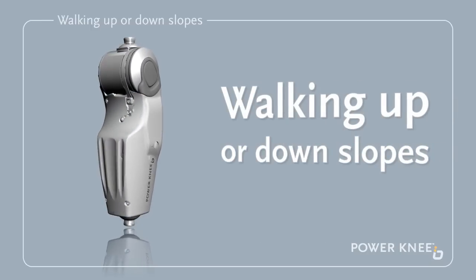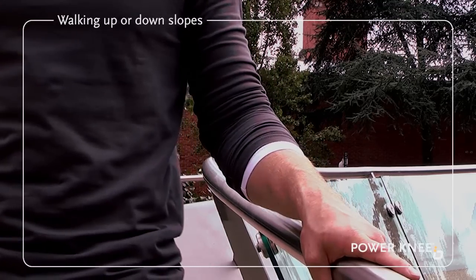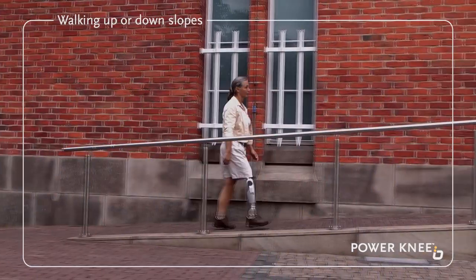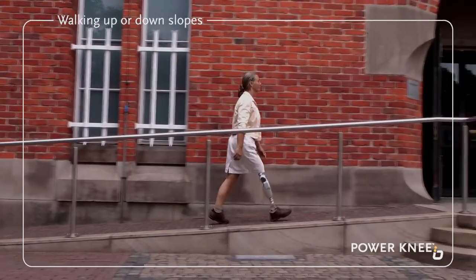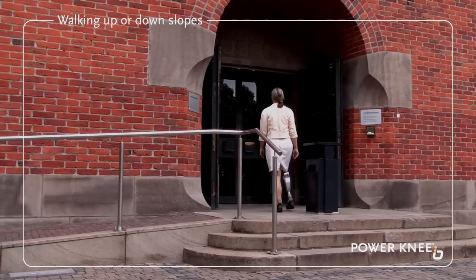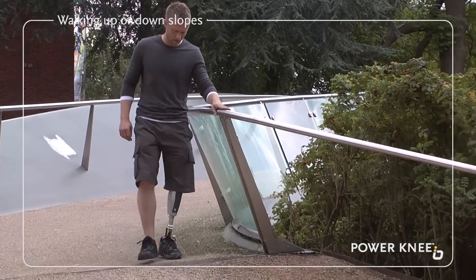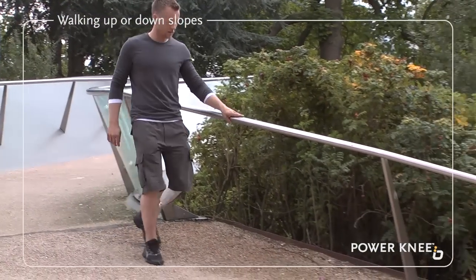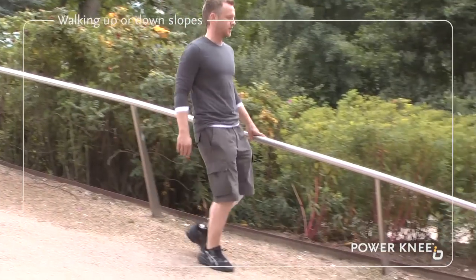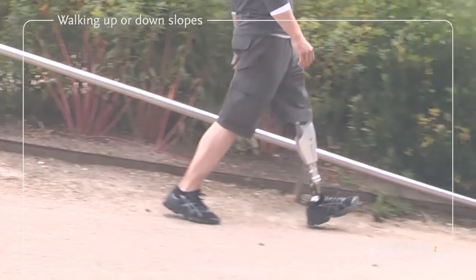Walking up or down slopes. We recommend you always use a banister or handrail while walking up or down stairs or slopes. When going up slopes or ramps, you should simply walk at your normal pace. The same knee function is used to go up a slope as it is to walk on level ground. When going down a slope, you should try to lean slightly backwards, keeping your weight behind your knees in order to get the most out of the knee's slope-descent function.